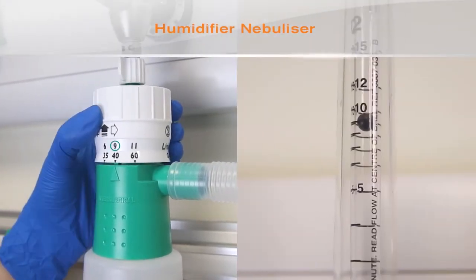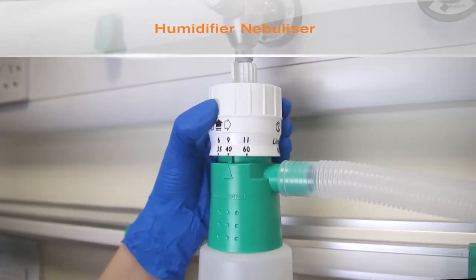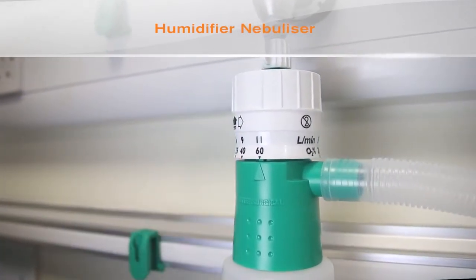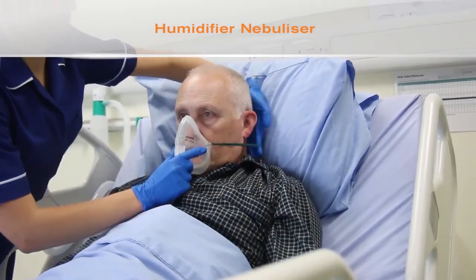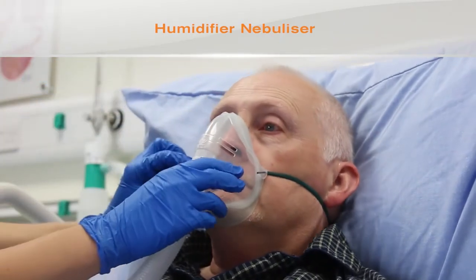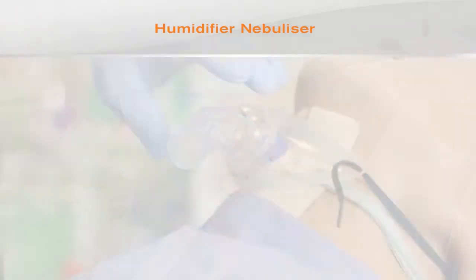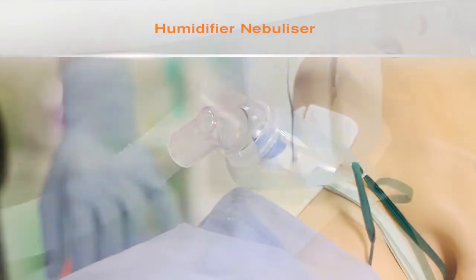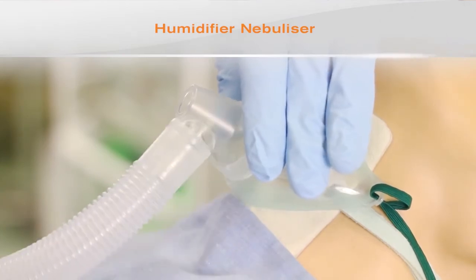Set the flow meter to provide the required total flow to the patient. The Intersurgical Aquamist makes this simple by indicating the appropriate flow above each oxygen setting. Then fit the delivery device to the patient. An aerosol mask should be placed over the patient's nose and mouth, and the elastic is adjusted to give a secure and comfortable fit. When using a tracheostomy mask, the mask is positioned over the patient's tracheostomy site and secured in place using an adjustable elastic strap around the patient's neck.